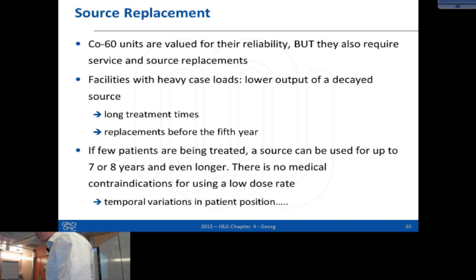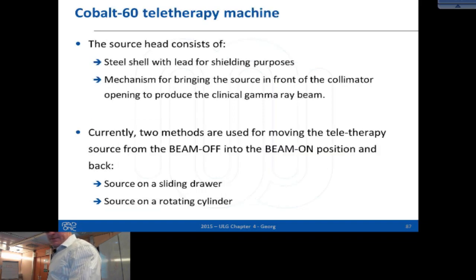And in that aspect, I will also touch on stereotactic radiotherapy, and there we can perform stereotactic radiotherapy, high precision radiotherapy for small volumes, with a LINAC or with such a Gamma Knife, and the Gamma Knife also uses cobalt. With a cobalt source, you have some shielding material. You will see that later on, and the source needs to be moved.